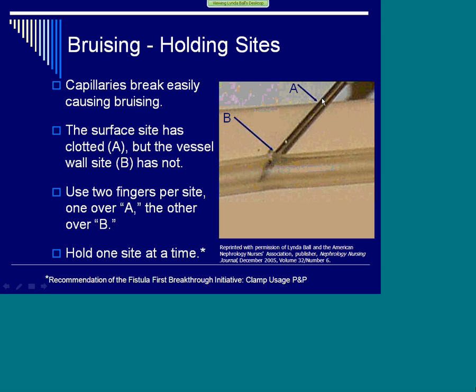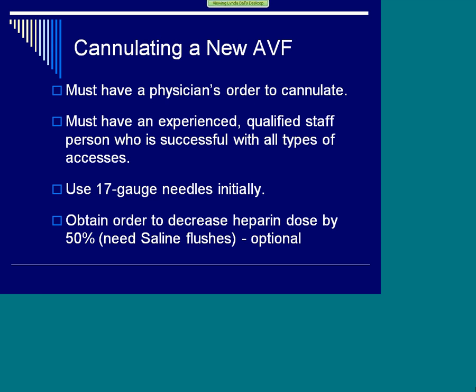We're always so focused on this one that sometimes our finger doesn't come over and cover this one up. This is where the blood is coming out. So we need to have two-finger holds, and we need to teach those patients right away that we do one side at a time, and they hold those sites in order to get good clot formation.